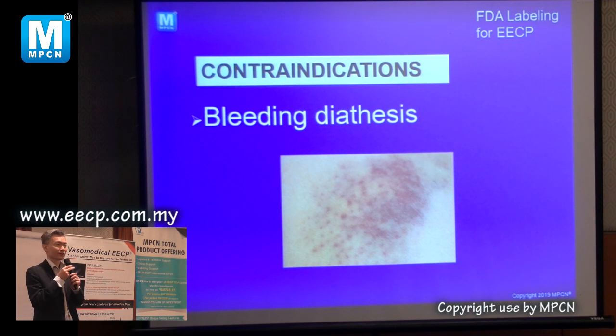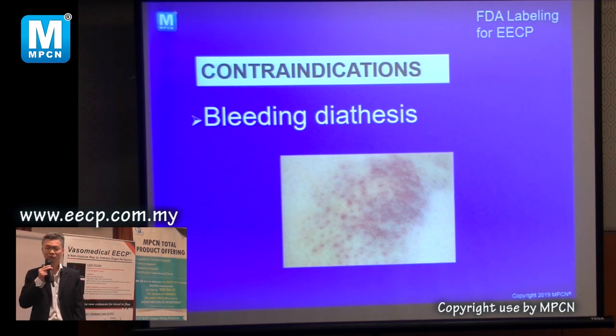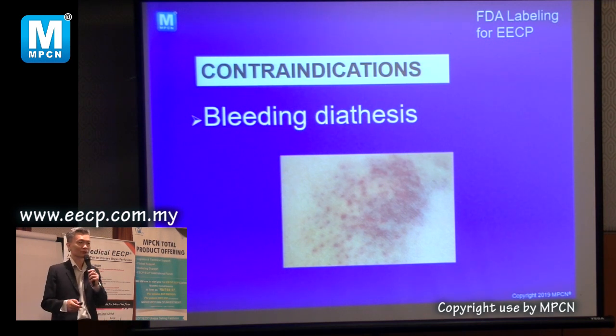Okay, another contraindication is that if you have a lot of bruises, bleeding, then don't do it, because it may cause more bruises, and then they will blame you and say that your machine caused it. One of the common side effects of doing this is that it can cause bad bruises and some scratches to the skin. So they must wear those soft pants, and also you have to watch out for this. According to the study, the most common problem is this.